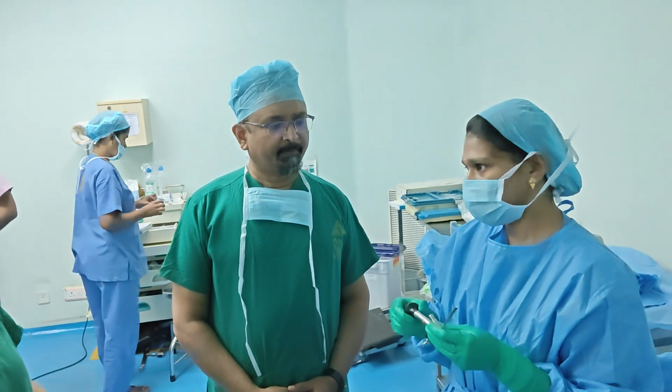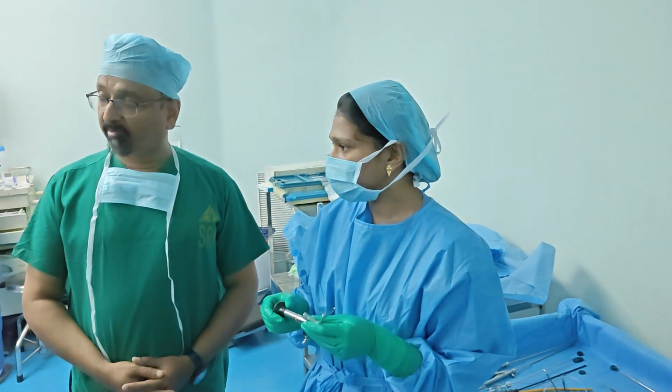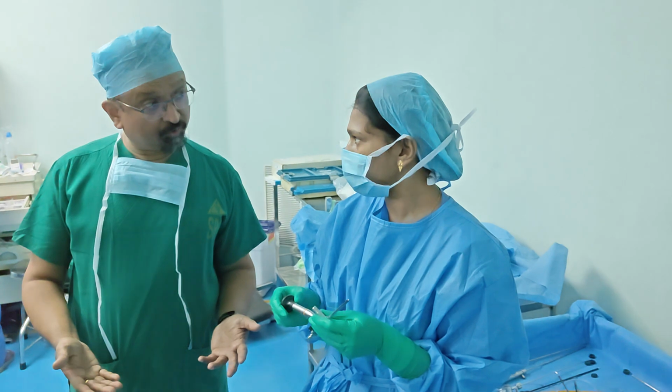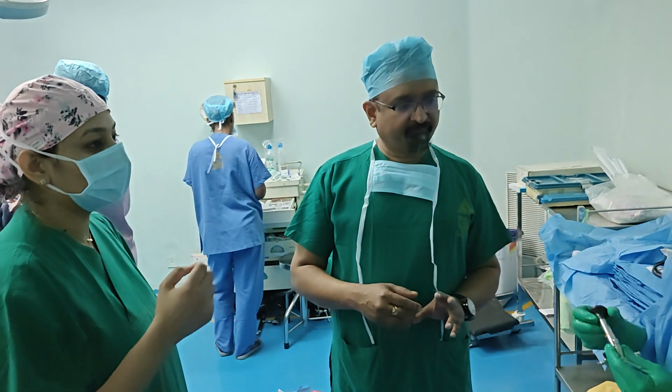So we do a cystoscopy to check if we have the stent. Now what is the other way this can be useful? In case of stent removal. No, the stent does not go. If it is not passed, then in that case you can put a cystoscope and then put a stent from below.